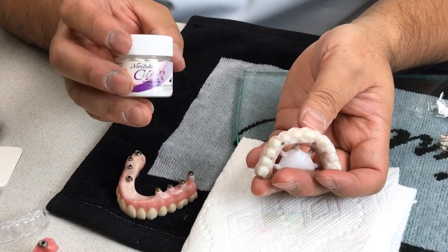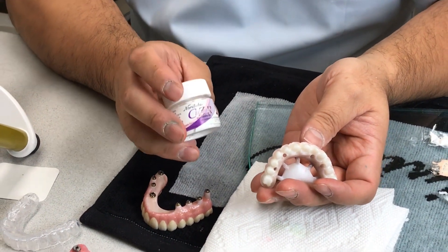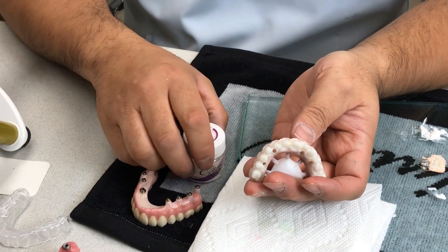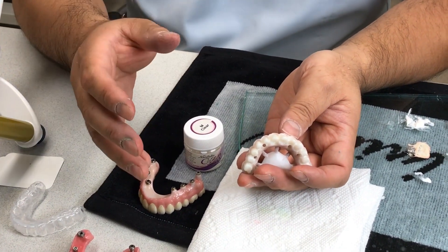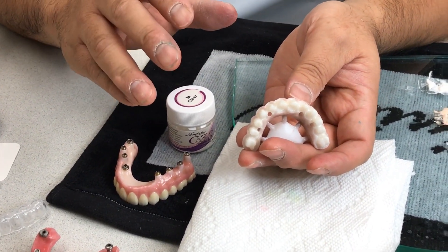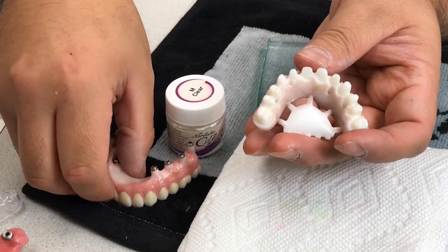What I always use is this technique from Noritake — they have a margin porcelain that is a real high-fuse ceramic. You have to heat it up to around 1000°C, and I go a little higher, around 1100°C, and hold it for about three minutes.